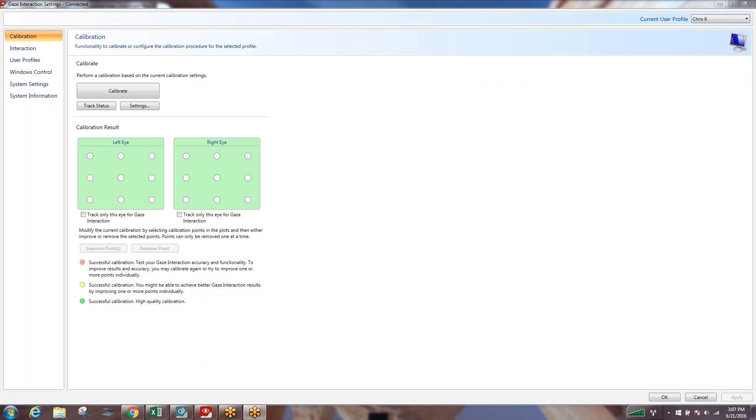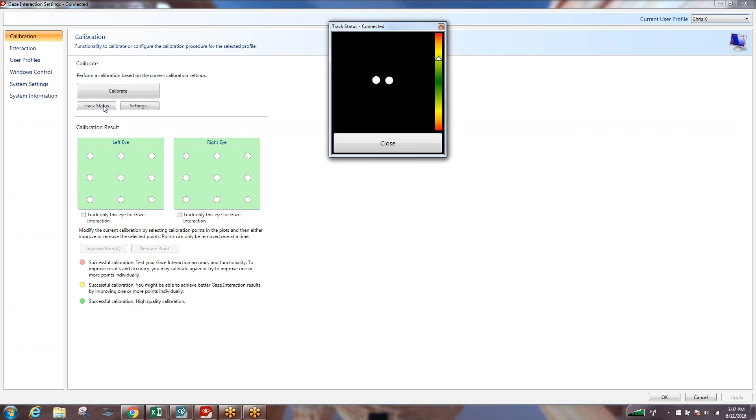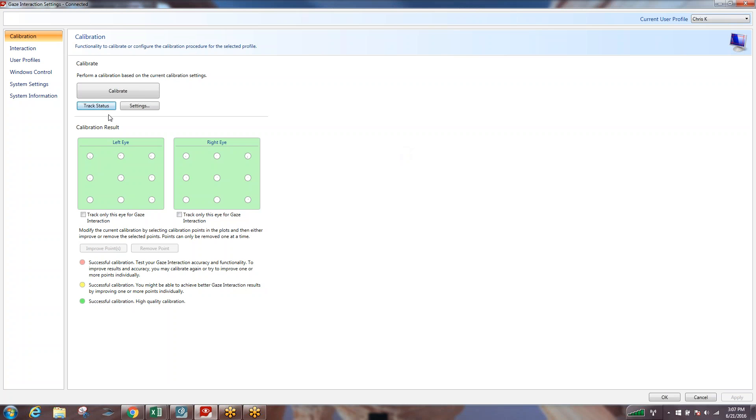We've already accomplished the positioning in a prior video and now we're going to transfer right into actual calibration. We're going to talk a little bit about some of the settings and some of the adjustments we can make within calibration. We've opened up our gaze interaction settings and we've already gotten ourselves into the proper position.